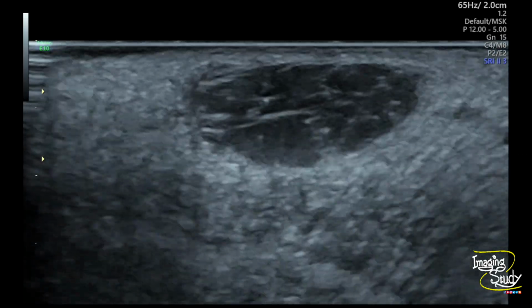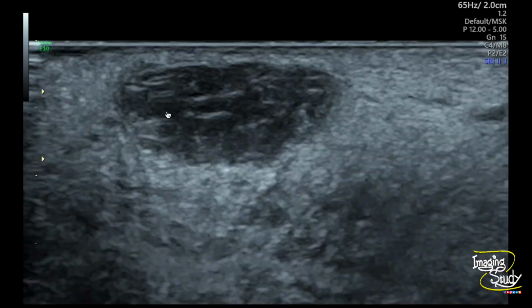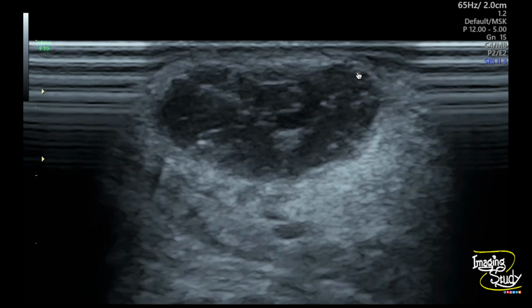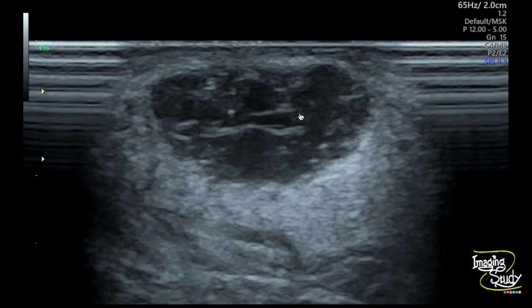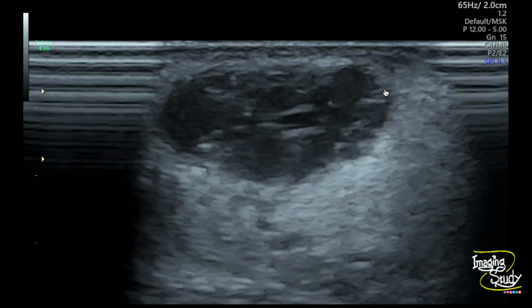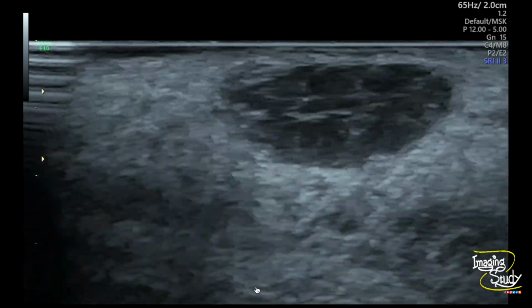Here with high-frequency ultrasound, you can see an oval lobulated mass within the ventral aspect of the left lateral mid-tongue. This is a hypoechoic mass and it's slightly compressible. During compression, on grayscale, you can see something moving within this lesion. You can see some striated-like pattern. The moving particles with this striated pattern indicate it consists of some venous channels.